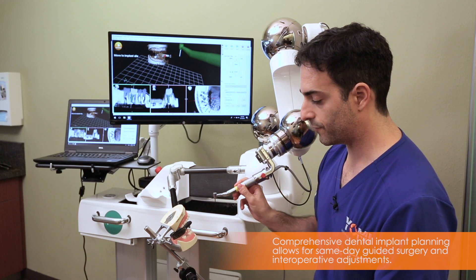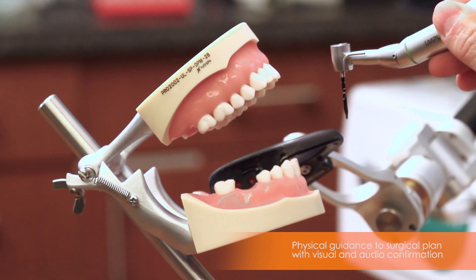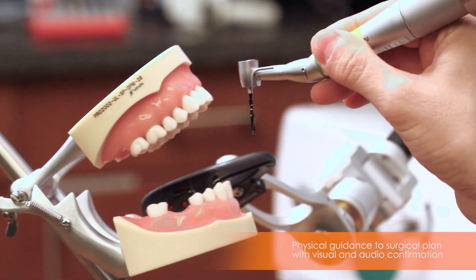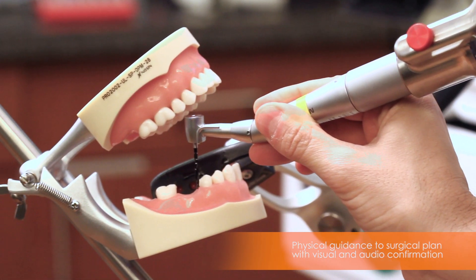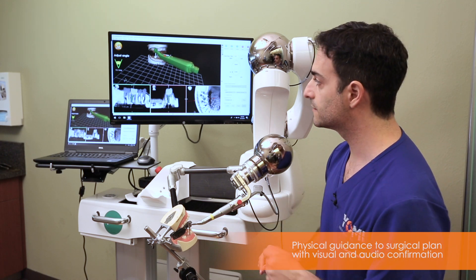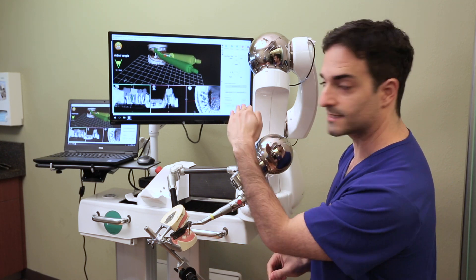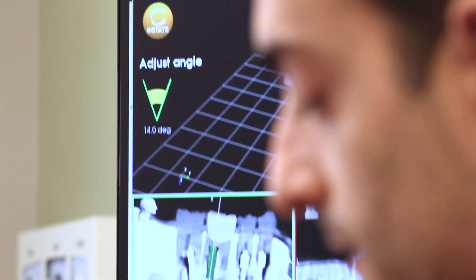At this point, the robot arm is in guided mode, so it's free to move anywhere when I'm far from the site of surgery. But as soon as I get within a few millimeters of the surgical site, it's going to stop me, and it says the angle needs to be corrected to match the plan. On screen, it shows me to tilt the handle up. It shows me my angle error is about 15 degrees off.